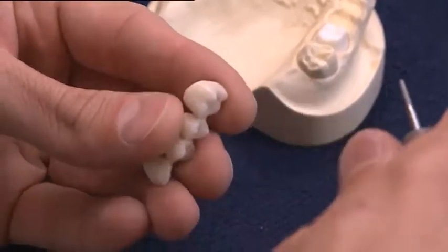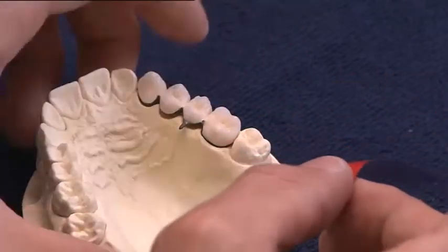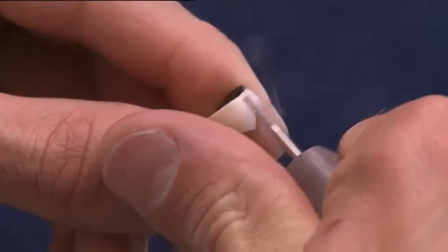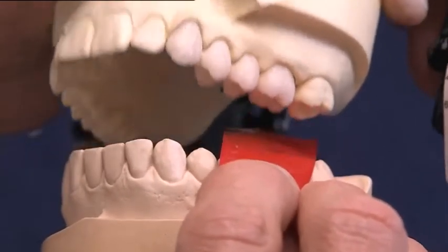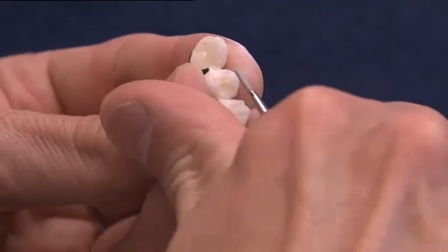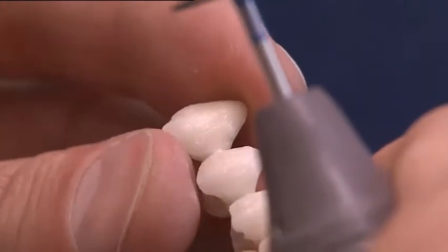The ceramic bridge is finished with the recommended grinding instruments. The occlusal contacts and proximal contact areas are checked on the model and in the Stratos and adjusted by grinding. Subsequently, a thin diamond disc is used to separate the interdental areas down to the opaquer.